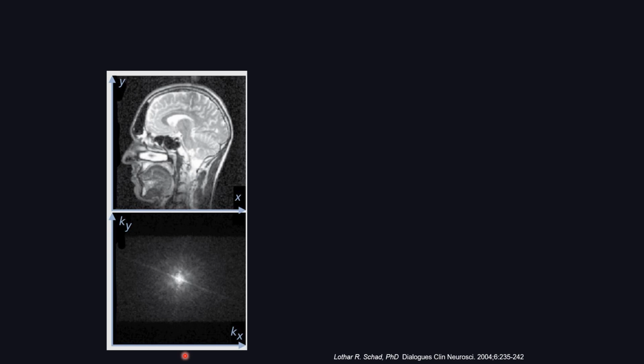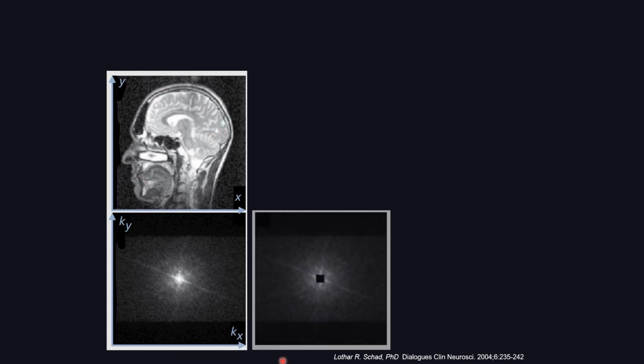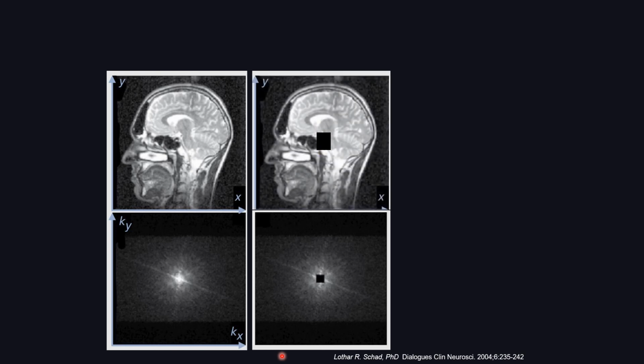If you come across a question like this, where you have a K-space and a final image that look like this, and the question asks: there's corrupted data in the center of K-space, all the data in the center of K-space has been lost, what does the resulting image look like? The choice that you don't want to pick is something that looks like that.